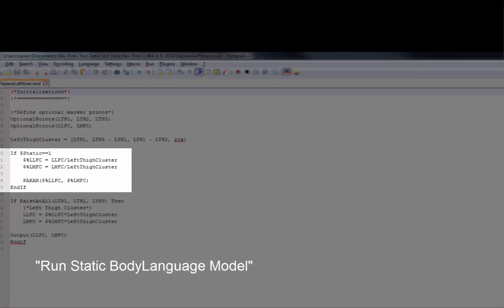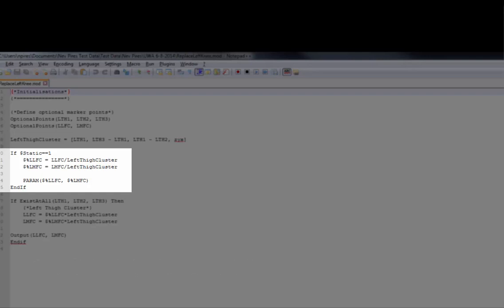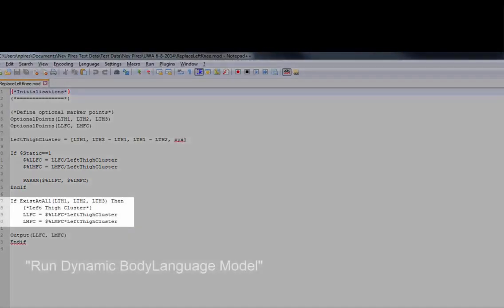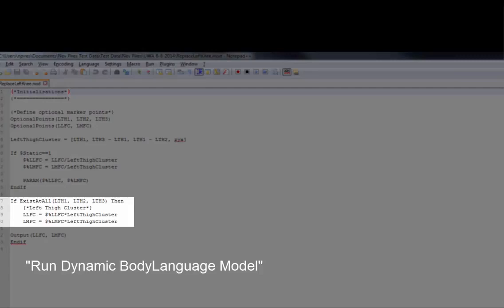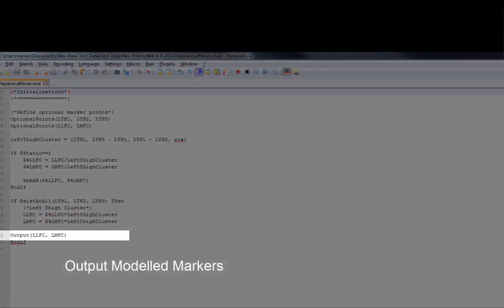What we're doing here is placing the knee markers in the local coordinate system of the left thigh cluster. In the second if statement, which is run in the dynamic body language model part, we're saying that if the markers of the left thigh cluster exist, then we can recreate the knee markers in the global coordinate system. Finally, the markers will be exported as modeled markers.